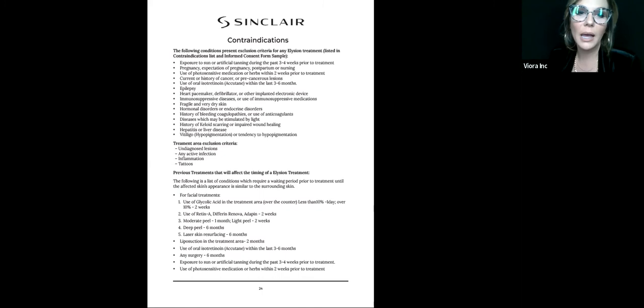Contraindications, I'm not going to fully go through all of these just time-wise. I do have a webinar on contraindications across the board for all of our technologies, and I speak about the ones for hair removal as well. They're also on the consent form. So definitely watch the contraindication webinar if you need a review of that and why. I may talk about the IPL hair removal on that webinar, but it's the same thing. For instance, vitiligo is not on the contraindication list for our radio frequency handpieces, but it is for our laser and light-based technologies. Why? Because these devices are attracted to pigment, and when they have vitiligo, it can create permanent loss of pigment in that area. So there are some contraindications that are a little bit different for a laser-based technology. But again, I cover that in the contraindication webinar. You won't miss anything there.